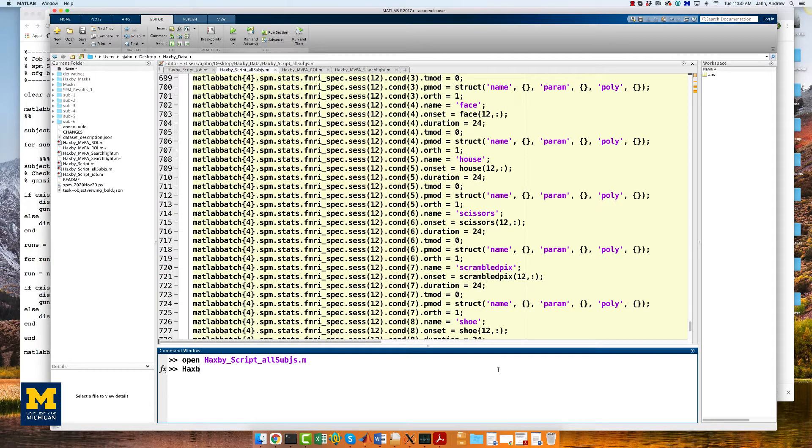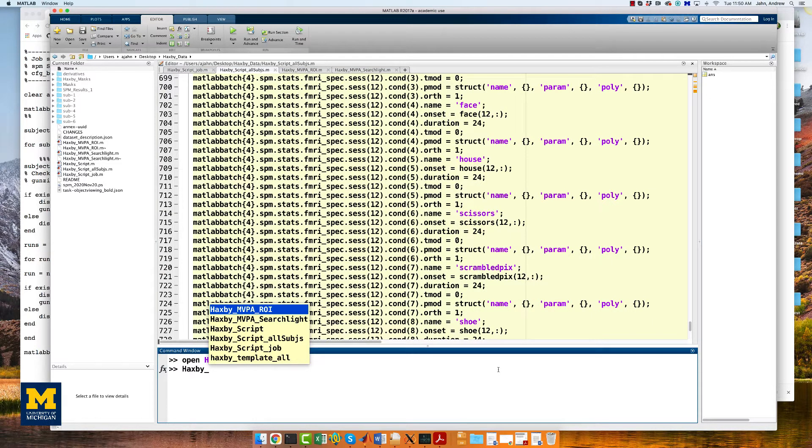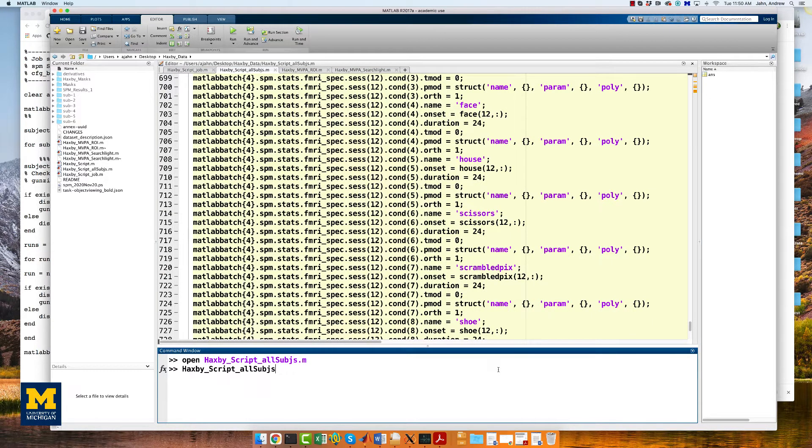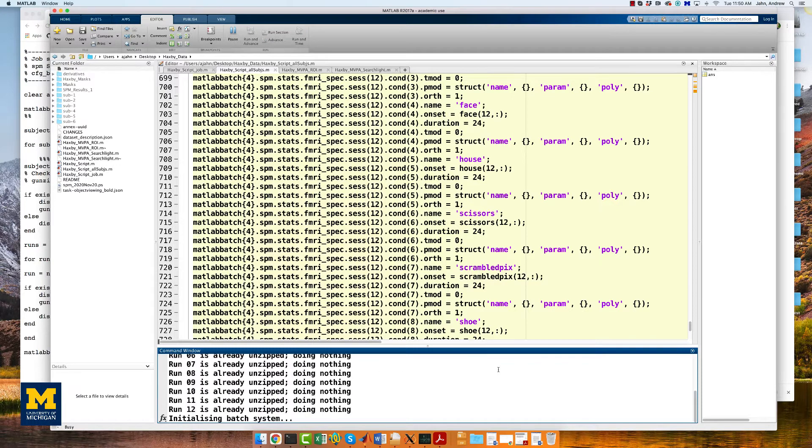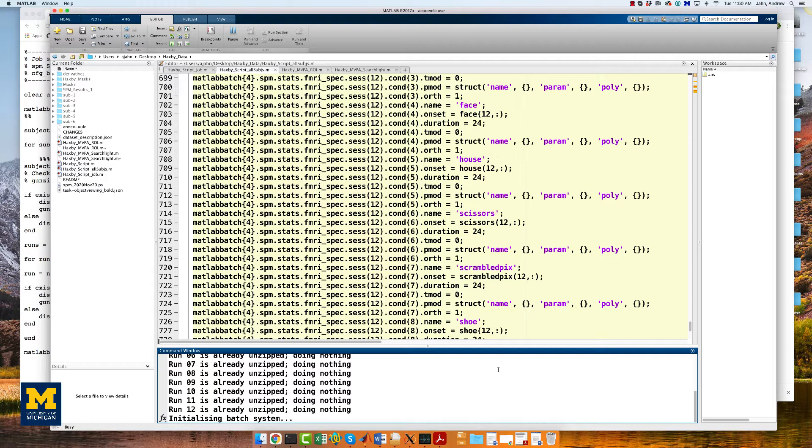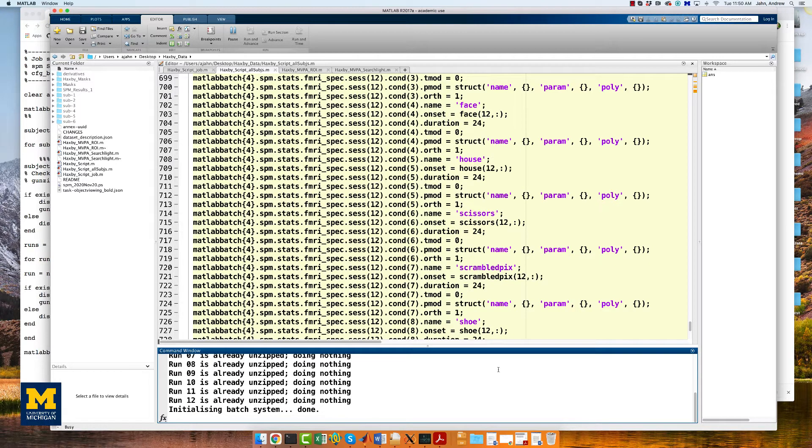Once you've finished reviewing it, you can run the script by typing Haxby script all subjects. And then it will run through each of the subjects and do the pre-processing just as we did a few videos ago. I'm going to fade out here and come back when it's done.